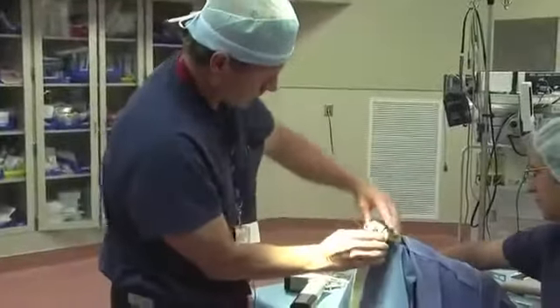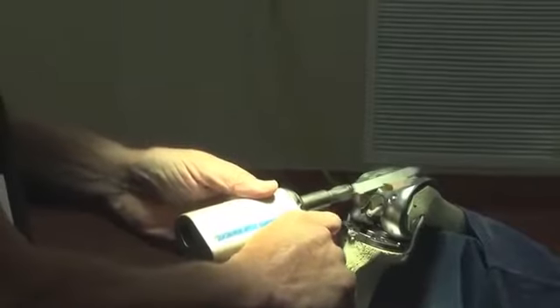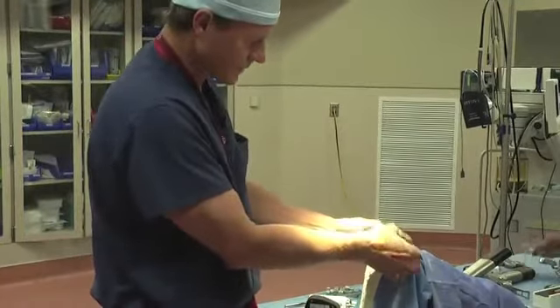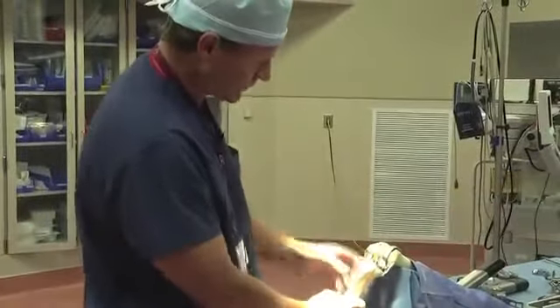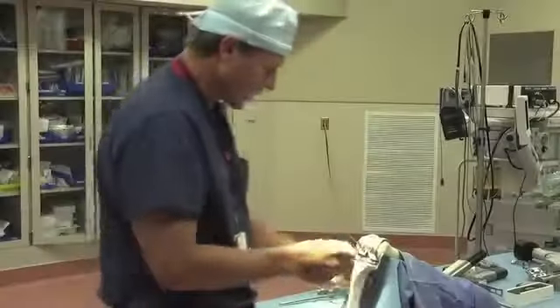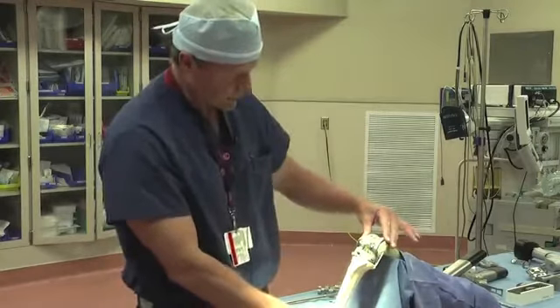We'll put our femur into place. Next, to finish the groove for where the patella will ride in the implant, we'll make a little cut along here. To finish this so we can trowel it, we'll go ahead and put this plastic piece on for the trowel. Now the femur is completely prepared, and we have to determine what size of our polyethylene component — the piece that will fit between the two metal components — will be. We'll go ahead and snap this into place, and then we have our trial implant on.